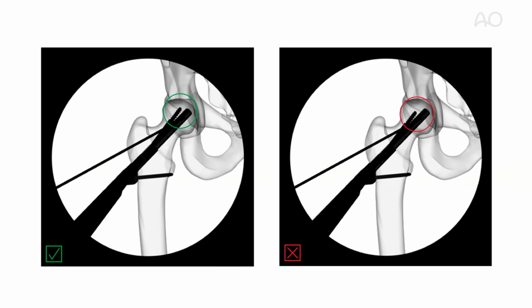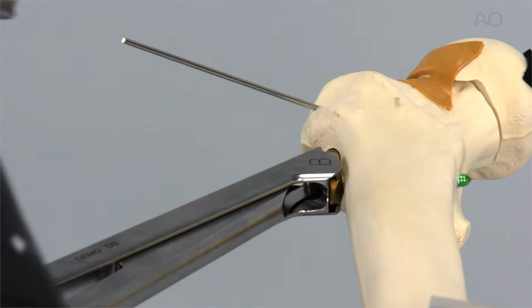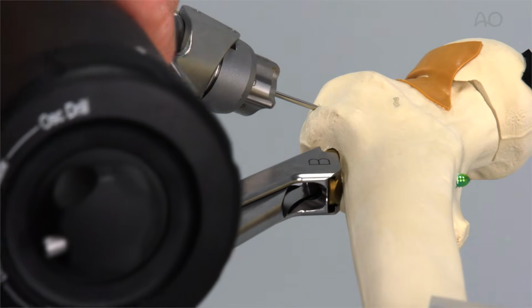The tip of the anti-rotation screw should be in a similar insertion depth when compared to the tip of the bolt. The notch of the anti-rotation screw should be at the same level as the notch of the plate barrel. The stabilizing wire is removed.